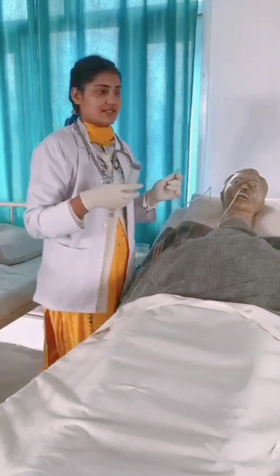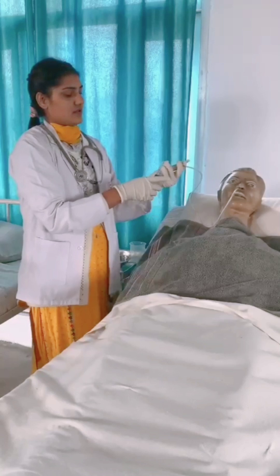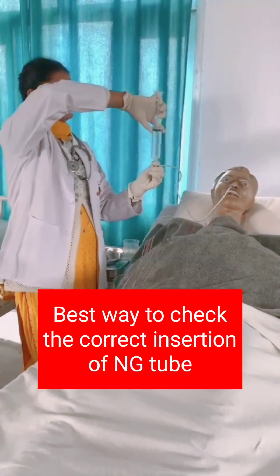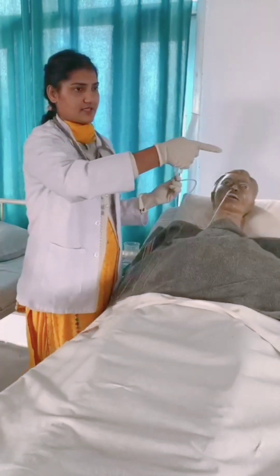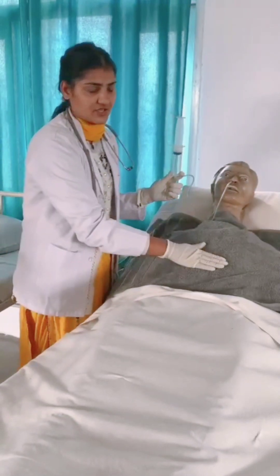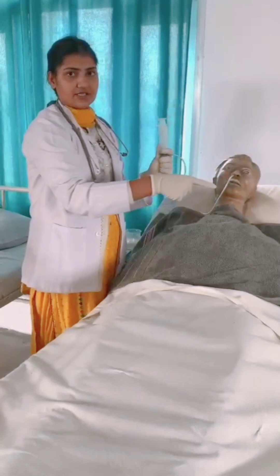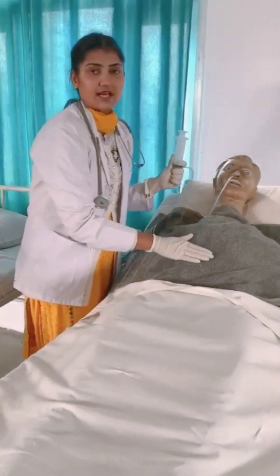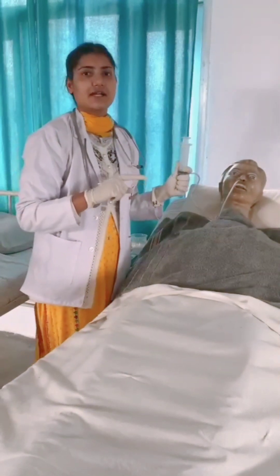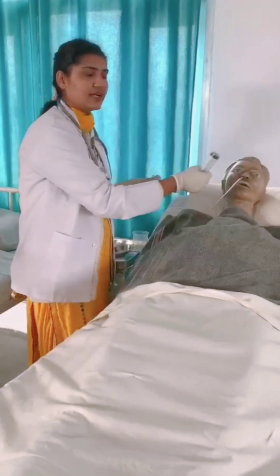There is a second way to check the correct position of the tube. Open the tip of the nasogastric tube and connect the syringe. Give the stethoscope to another person and have them place it on the abdomen of the patient. Then press the syringe with force — if the other person hears a proper gurgling sound inside the stomach through the stethoscope, it means the nasogastric tube is at the right place. If the patient is feeling any respiratory distress, remove the tube from the nostril.